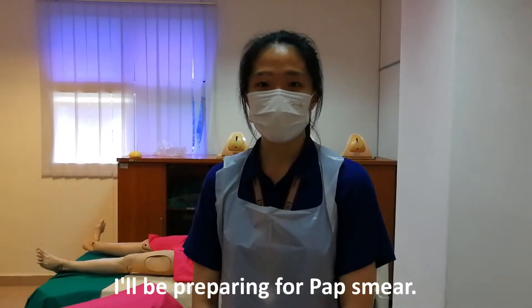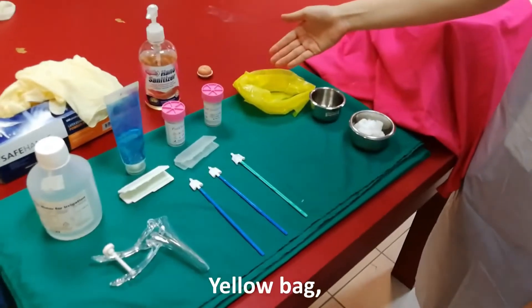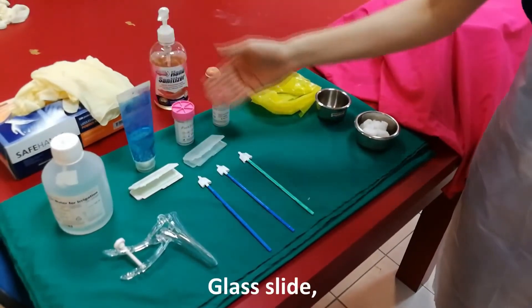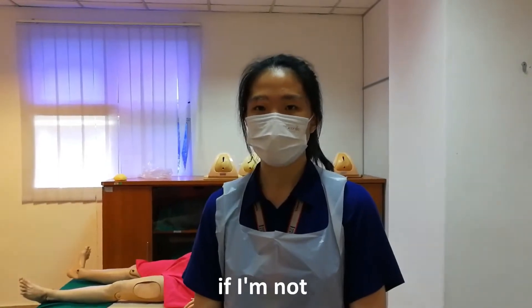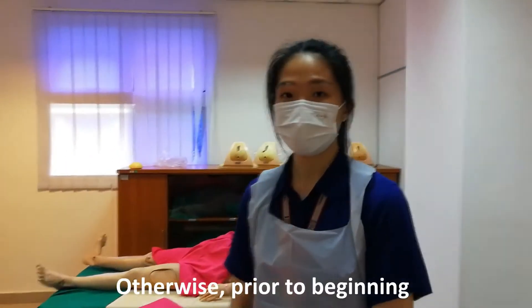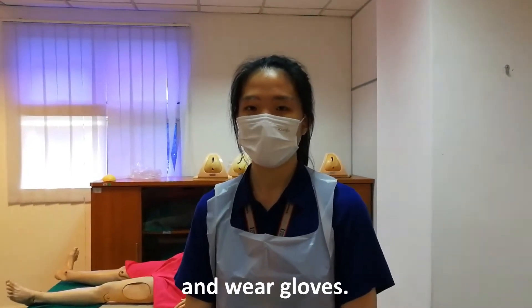These are the materials that I will be preparing for the pap smear: cotton, yellow bag, cytobrush, speculum, normal saline, lubricant, glass slide or sample pot. I will also prepare an alcohol solution to fix the specimen if I am not using a liquid-based method. Prior to beginning the procedure and touching the patient, I would like to wash my hands and also wear gloves.